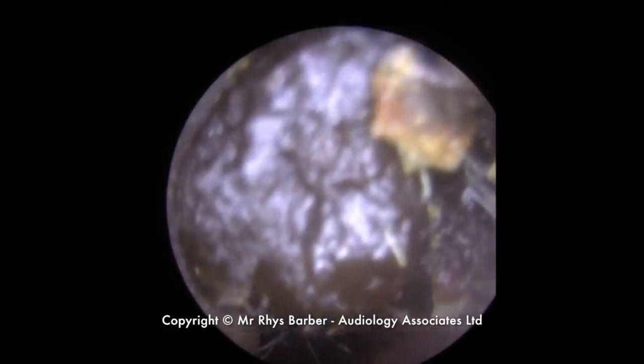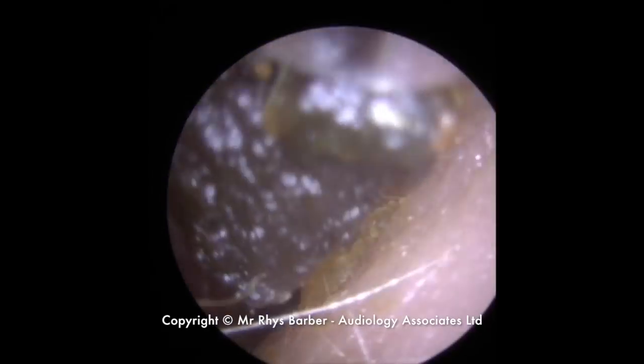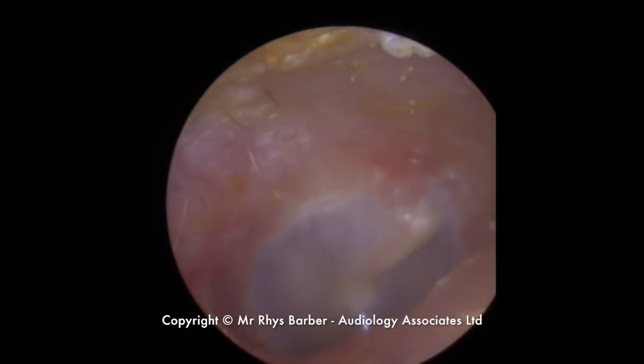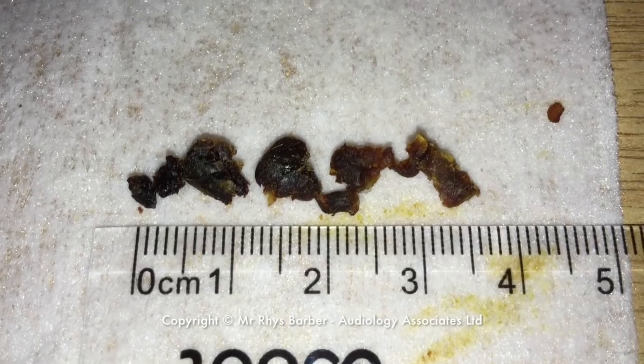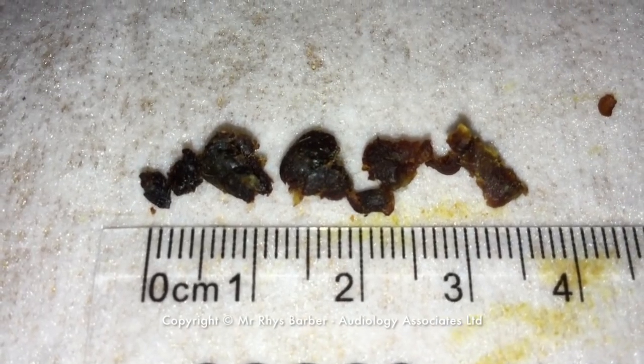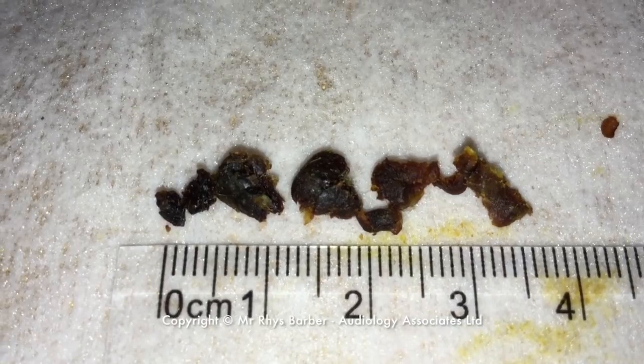You can see this is looking a little bit darker, this wax. Guys who watch the videos a lot know that the darker the wax is, the older it is. And there we go, there's the eardrums all looking nice and healthy. This is what we removed. You can see the lighter wax to the right hand side, darker wax there to the left, so newer at the right and older at the left. All looks nice and healthy.